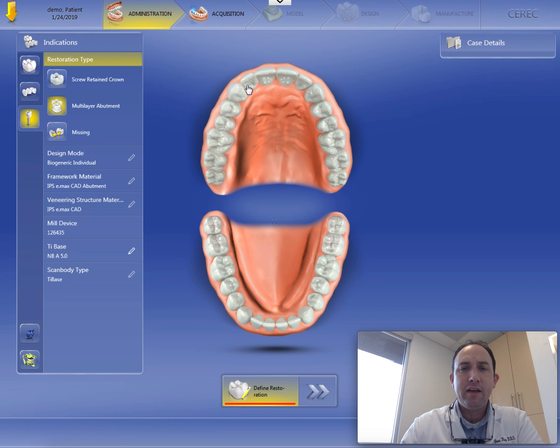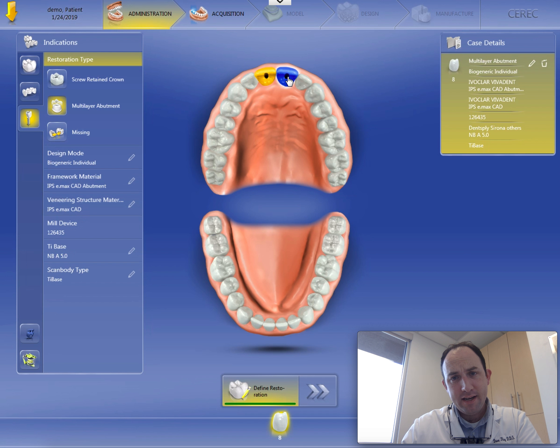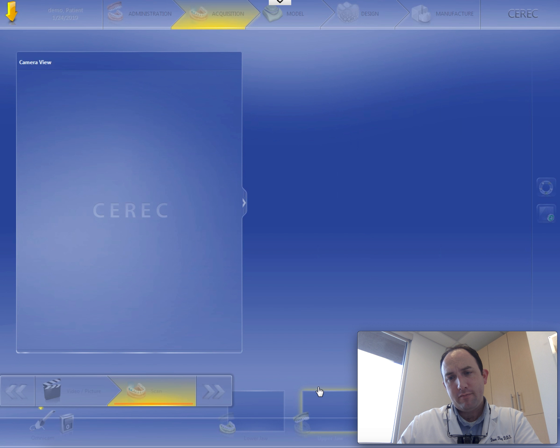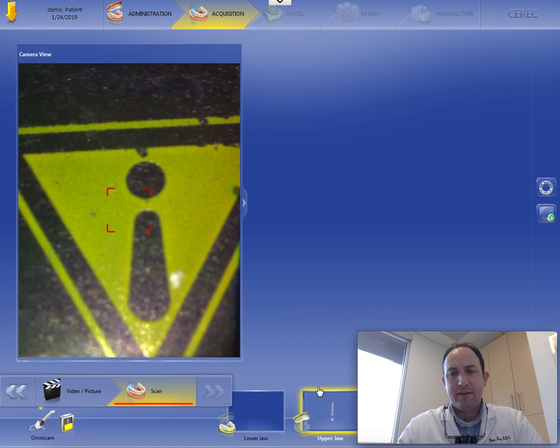So we've got all these set up. I'm just going to click the two teeth we're working on — number eight, number nine. Just verify everything over here is correct, and then we can go over to the next step. This is the scanning step.